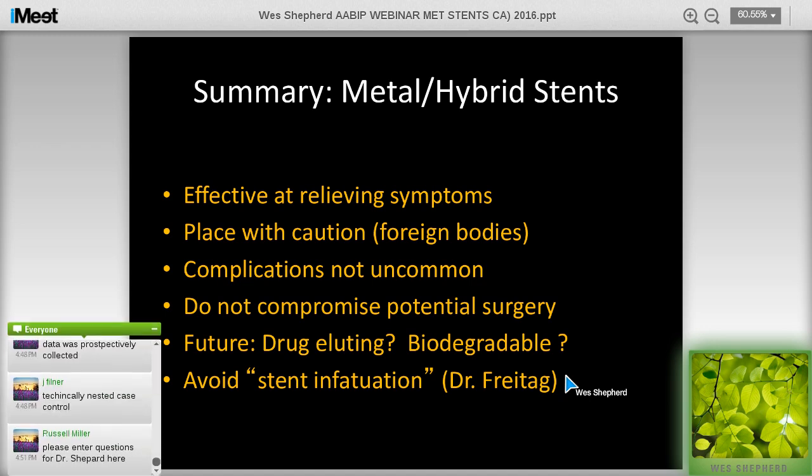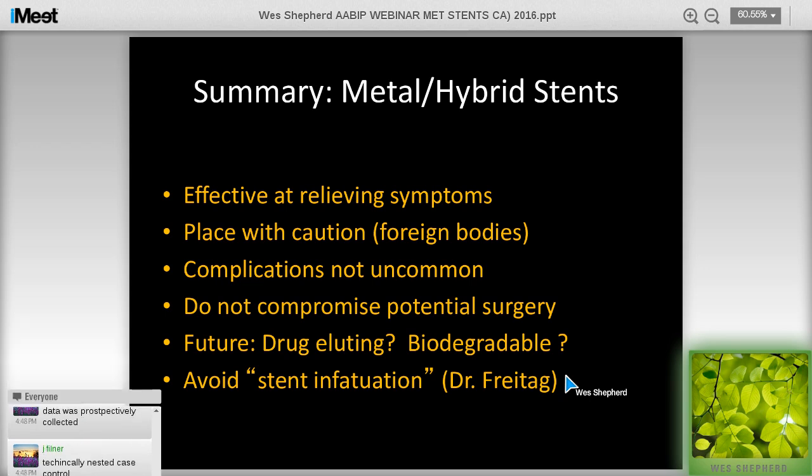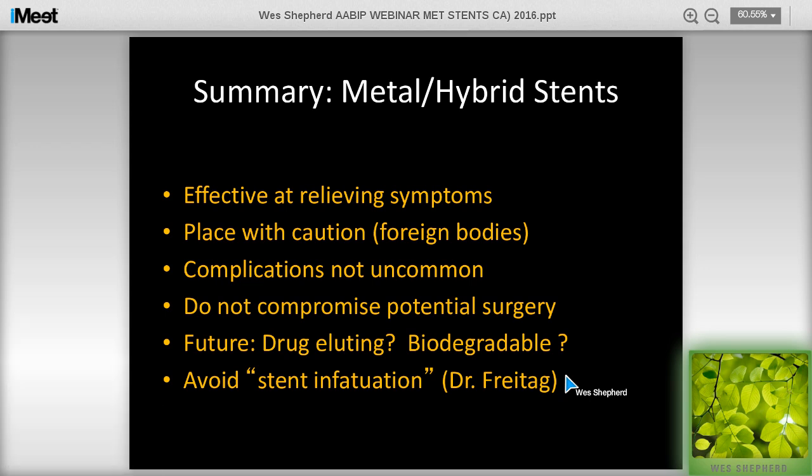And my favorite stent-related quote came from Dr. Louis Freitag that I heard a few years ago, which was stent infatuation. And I think it's so important for us as practitioners who place stents. Again, the old saying, just because we can doesn't mean we should, and I think we should weigh very carefully the options and considerations before we place an airway stent. So thank you very much for your time.